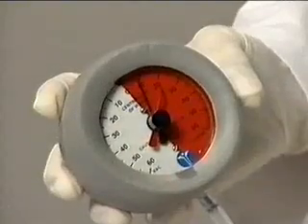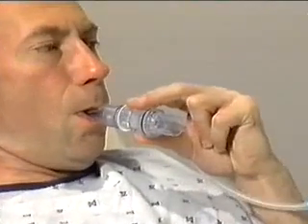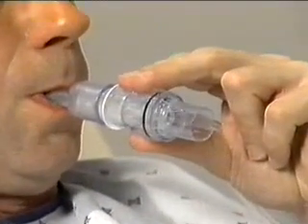While monitoring the airway pressure, slowly adjust the flow meter until the desired expiratory airway pressure is reached. Slow inhalations and exhalations by the patient will maintain adequate airway pressure during the breathing cycle. EzPAP is intended to be used on an intermittent basis and not for extended periods of time. EzPAP can be used with a nebulizer to provide simultaneous aerosol drug delivery while performing therapy for lung expansion.